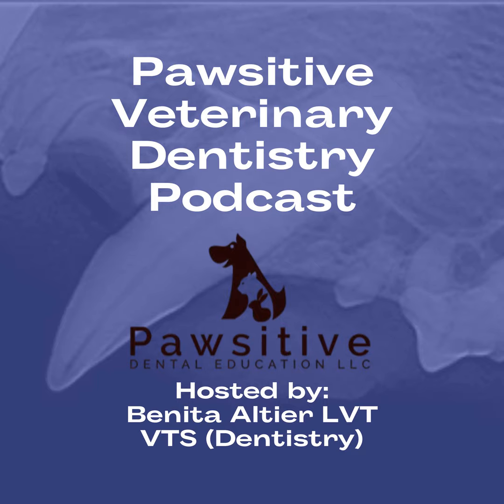Those are the ones we get a little bit more twitchy about, because those teeth are usually under-erupted or completely unerupted. They're crowded. You have a lot of cases with hair stuffed in between all the different teeth and the roots, and you're not only digging out the hair, but random toy stuffing and all sorts of other things that could be trapped, and then you add all that debris that you can collect in the palatal folds, the rugae of the hard palate. So I would probably say just in general the brachiocephalics.